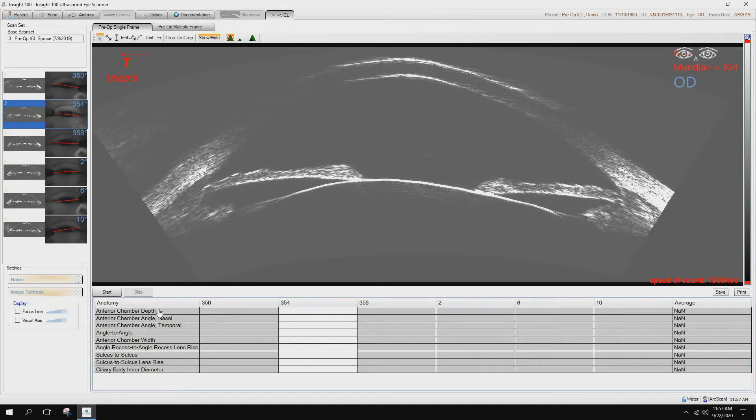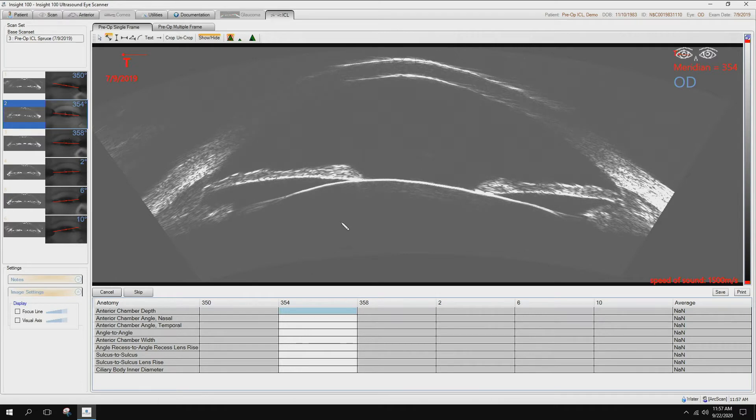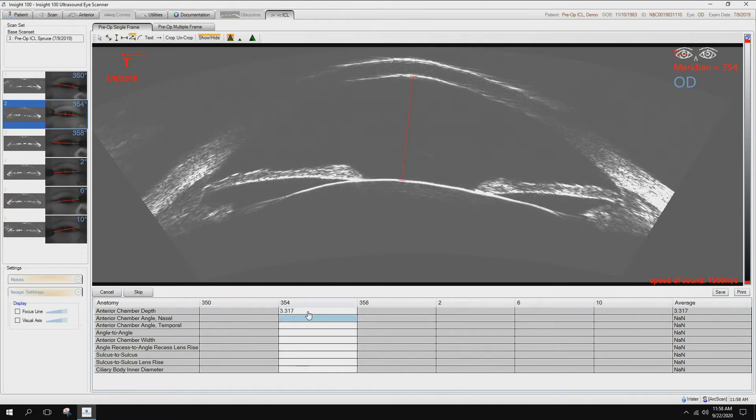Here's the order in which the measurements are taken. You can see here on this column 354. I hit the start button, highlighted as the first cell here that is for anterior chamber depth. Clicking the back side of the cornea, the anterior surface of the natural lens. It automatically populated that measurement in millimeters.